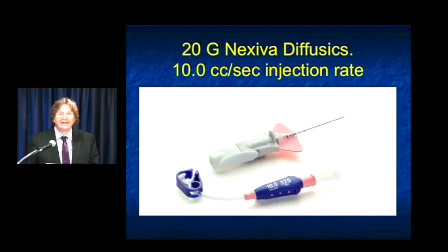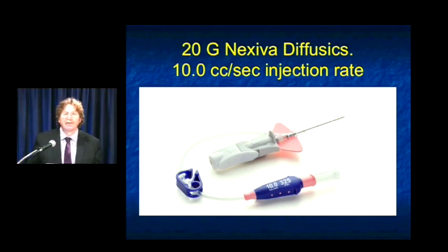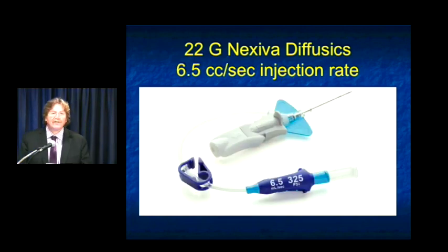And again, 10 cc's, and I'm told by the company off the record that, and obviously it's no surprise, when the FDA approves something, they approve a number like 10, but probably it can do 12 to 15, which we never will use. But again, this makes our life very easy. There's a slight learning curve for this needle.